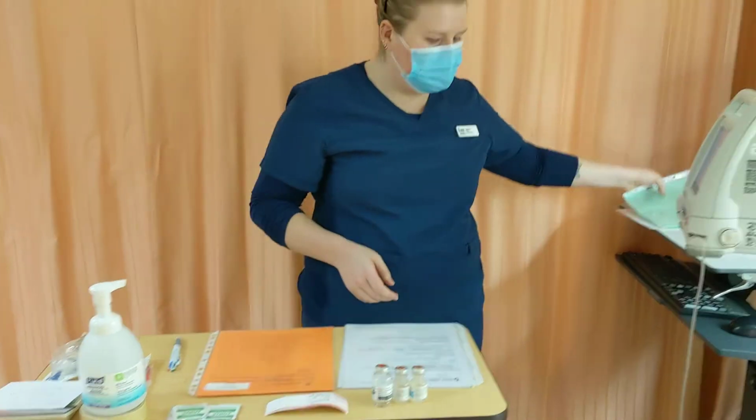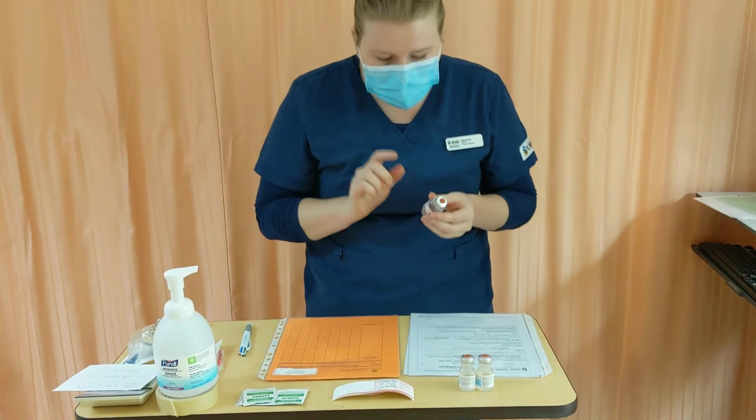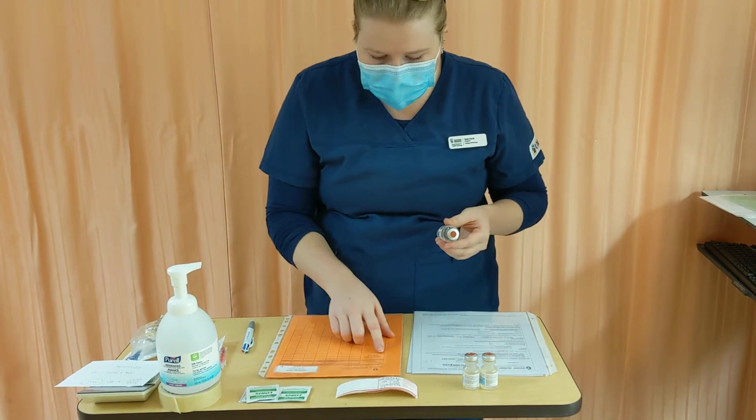So I'm just going to put my physician's order aside. I'm going to wash my hands, and I've already grabbed my right drug from the Pyxis. I'm just going to make sure it's not expired, and it's not expired. So I'm going to go ahead and do my first check here. We have Vancomycin, right drug. We have Fiona Friedman, right patient, 500 milligrams.